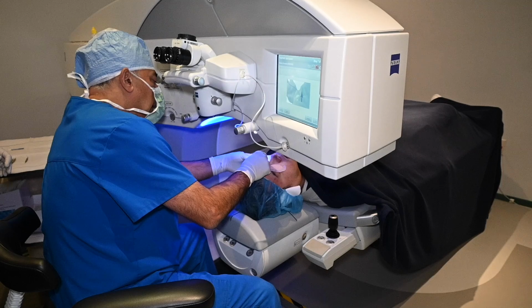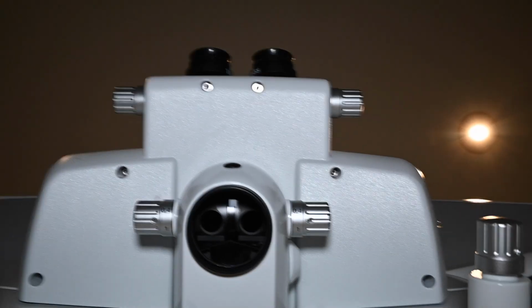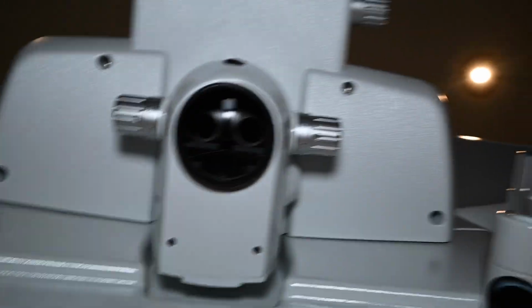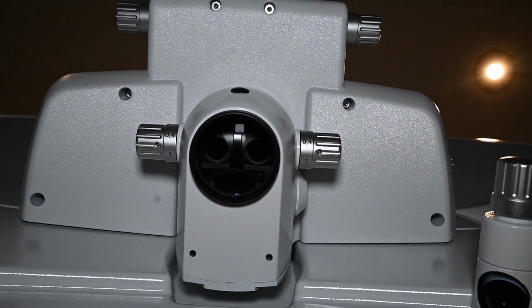Once you're comfortable, you'll be brought under the laser where you'll see a blinking line, and this is known as the alignment. And there's a patient interface which will attach to the laser and calibrate. So before every eye, we are calibrating again. As the bed is raised or the laser comes to you, the blinking white lights will become more clear and you'll be looking at there. And we'll be aligning to your line of sight, which is usually at the center of the pupil.